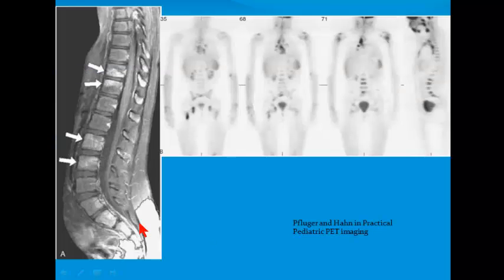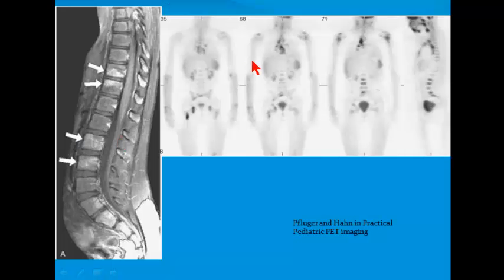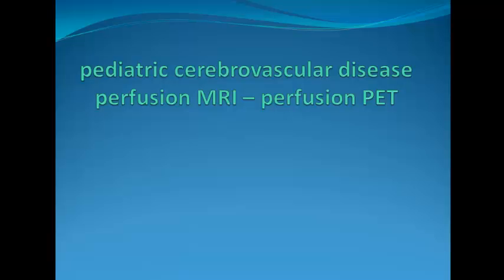12-year-old girl with back pain. Here's a case with non-Hodgkin's lymphoma where there was an area of enhancement on the MR that was thought to represent possibly inflammation or malignancy. They weren't sure, but they got the PET scan. The PET scan does show mediastinal disease and disease in bones, corresponding with the areas of enhancement on the MR. And so we have a situation where the MR is useful for imaging the spine, and the PET was good for correlating those lesions. So we see in this sort of scenario PET MR had added value over that of PET CT.